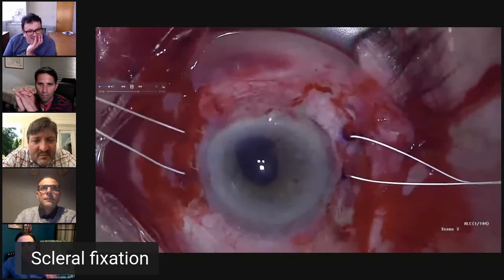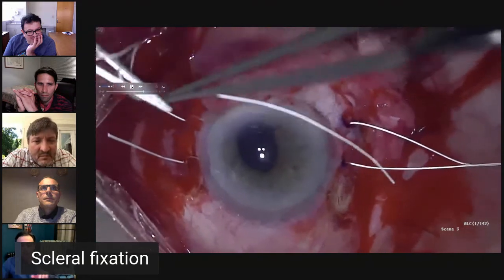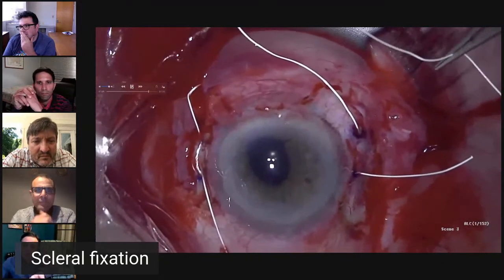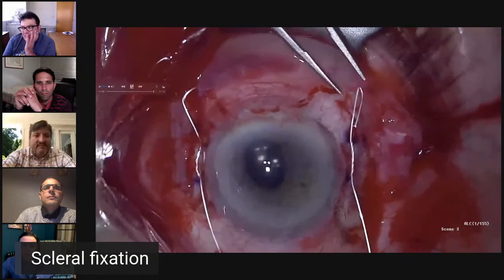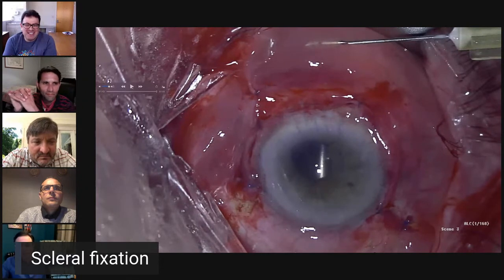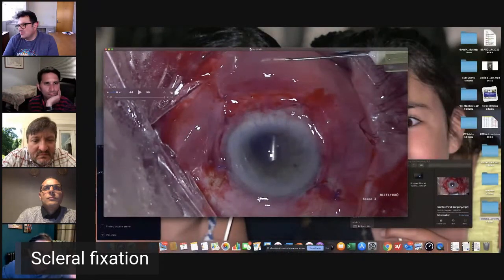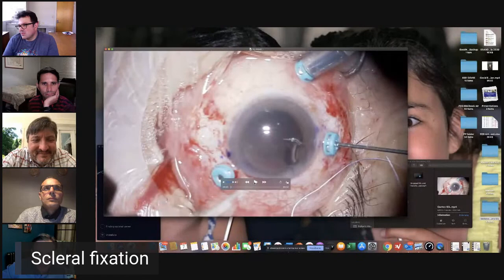Again, it went well. One of the things that I have to say is with Gore-Tex and this type of technique, be careful and be aware of where the loops are, where the ends of the sutures are, because believe me, it's very easy to get entangled. I ended up with one case where one side was twisted in one way and the other twisted, and I didn't even realize until after I finished the case and a few weeks later that I said, bloody hell, what's going on with this lens? It looks all twisted on one side and the other. So just be careful. As I said, experience gives you the thinking for other cases. So this is my second case, and this is, I think, one of my other cases.